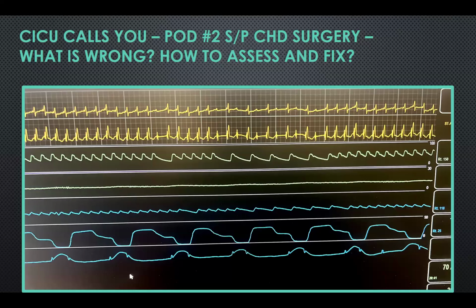Sometimes the atria in small children can be very friable, so it's not uncommon that atrial temporary leads will fall apart in terms of their efficacy and effectiveness of sensing and capture fairly early, and ventricular leads usually work okay, but again, almost by design, the leads are intended to not work great for very long. So it's a balance between having effective, adequate leads that work and not having leads that can't come out.